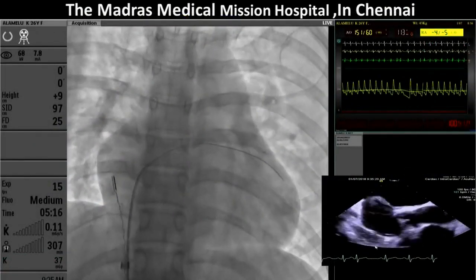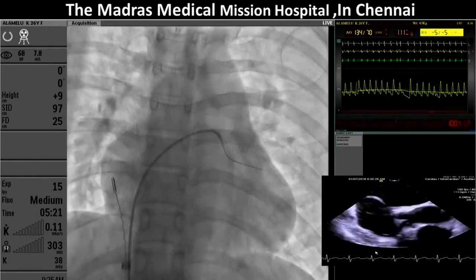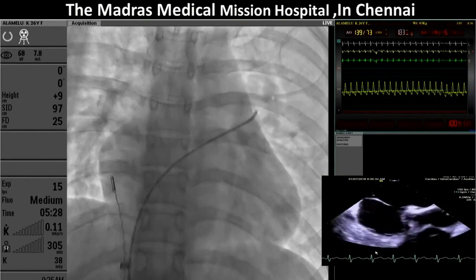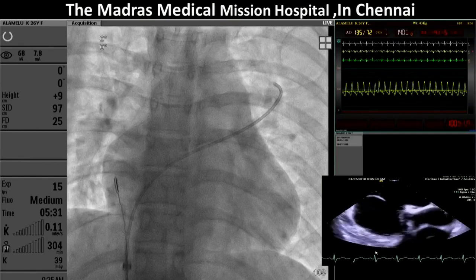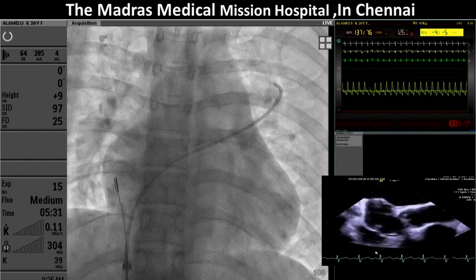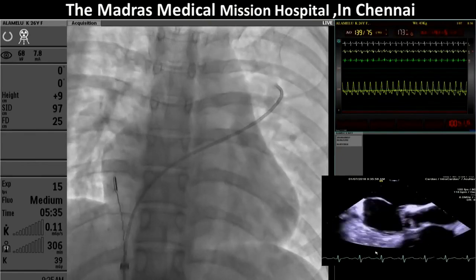Since Dr. Ajit was planning to show an intravascular ultrasound guided coronary intervention, we thought we will show an intracardiac echocardiography just to match. It's image guided intervention. Yeah, but the images are great actually. It's so easy to understand. Basically since it's a very close field, the pictures will be extremely good. There are no artifacts that are possible. The window is very, very clear. Resolution is very clear.